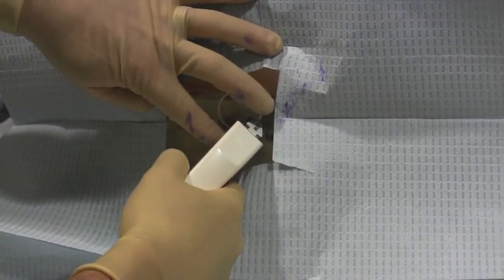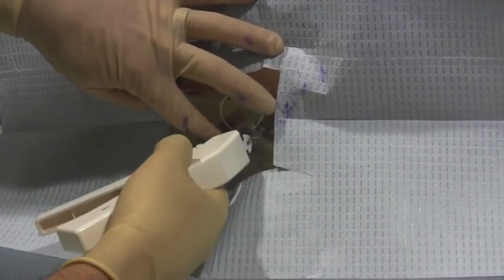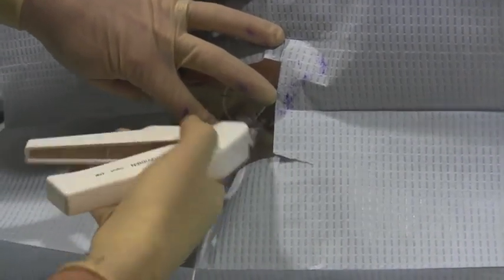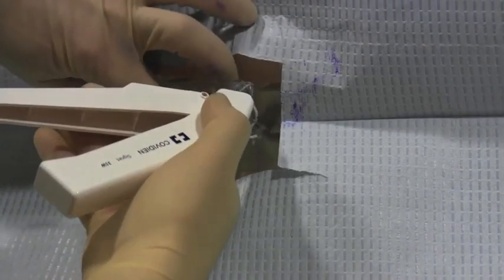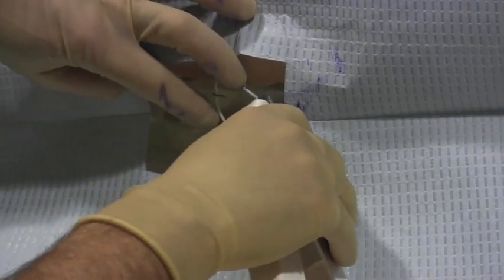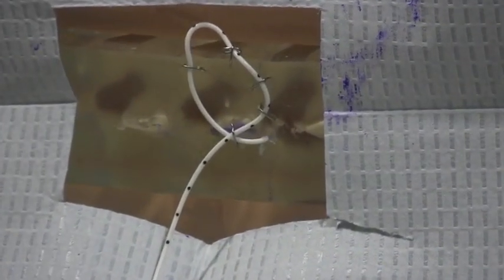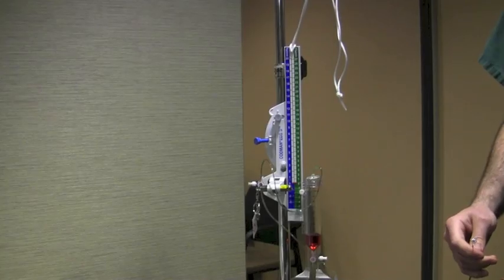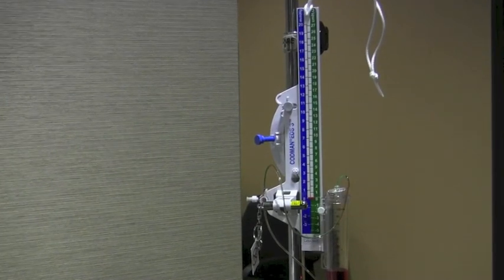A stapler is used to secure the tubing to the patient's back so that as the patient moves, the tubing does not come free. Here is the drainage system to which the catheter will be connected.